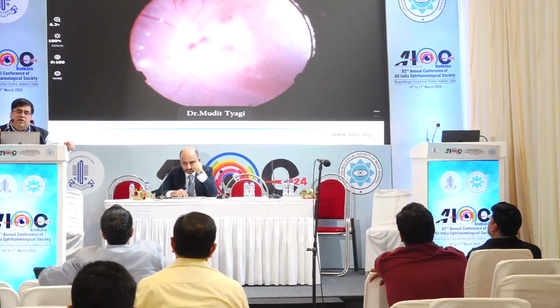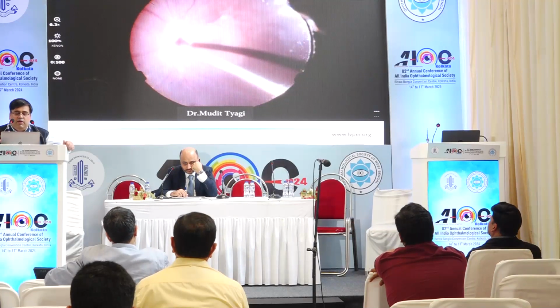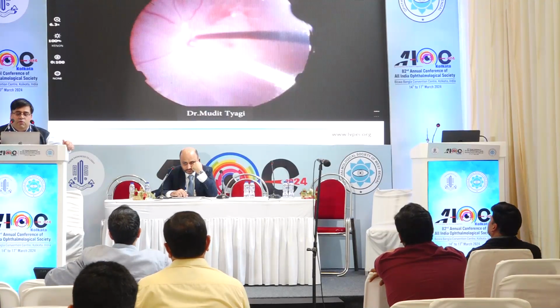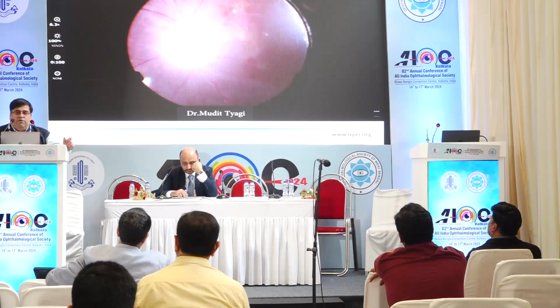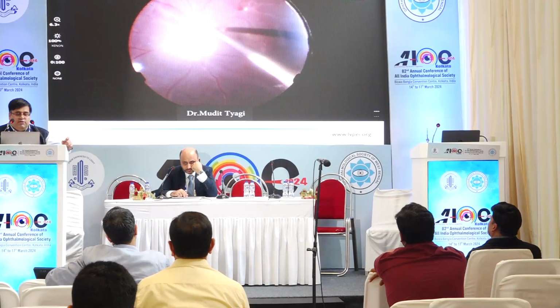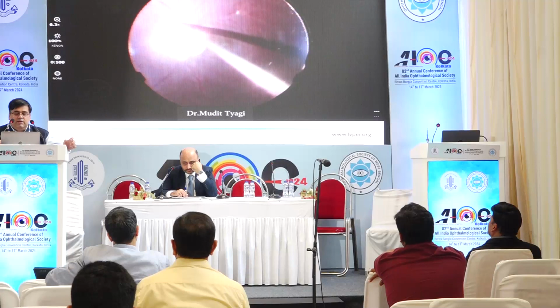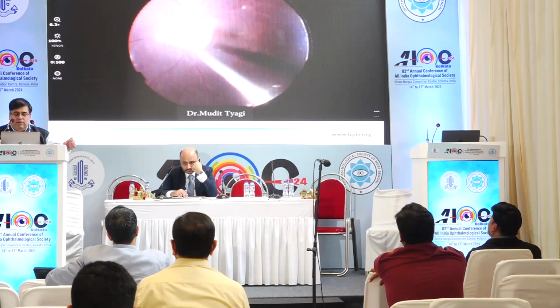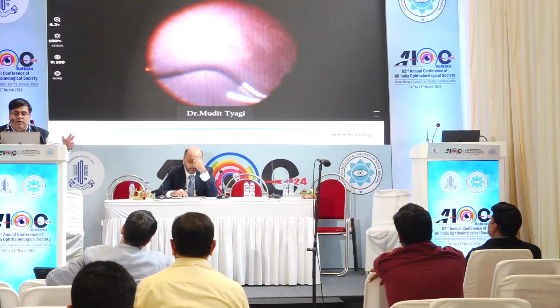So herein, what we have started doing is using fibrin glue, a drop of thick followed by a drop of thin glue you put on the disc. Initially glue was actually designed for CNS surgery, wherein you were using this as a coagulating agent. So you just leave a drop of it, a coagulum forms on the disc, collect it over the disc and just leave it there. You complete your surgery, laser.